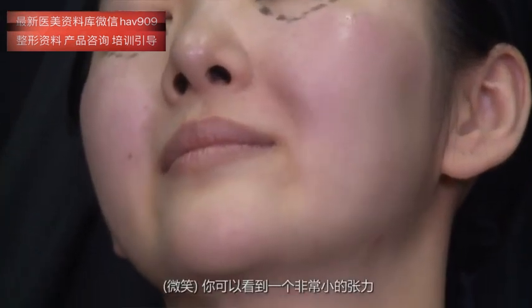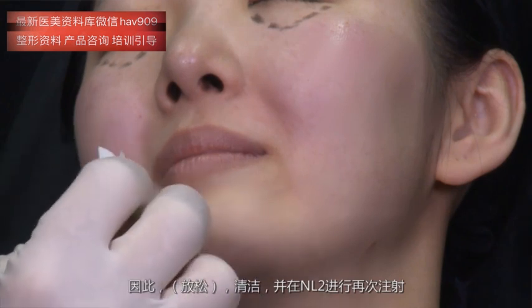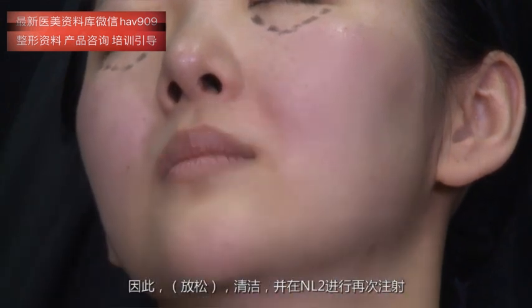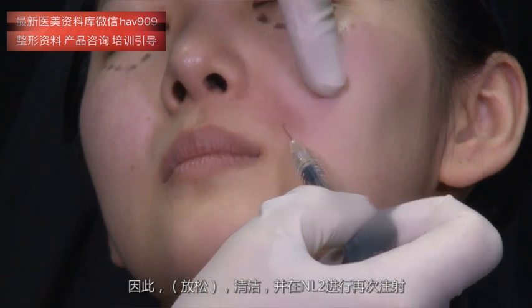Smile. I still can see a very tiny indentation, so relax, clean, and inject again in NL2.